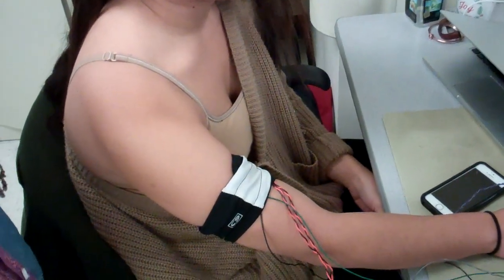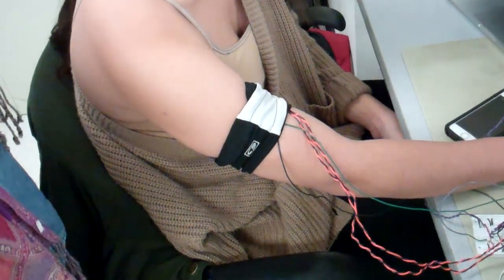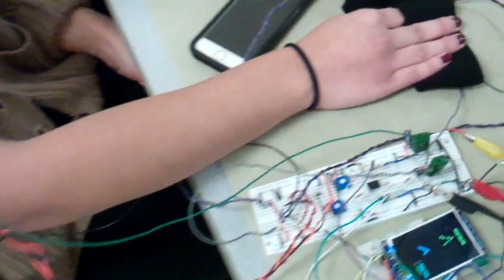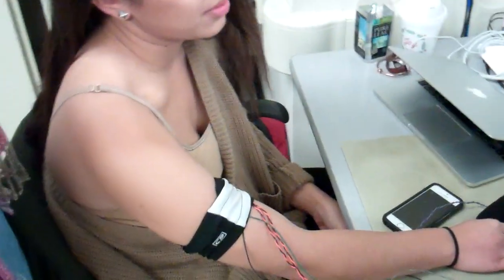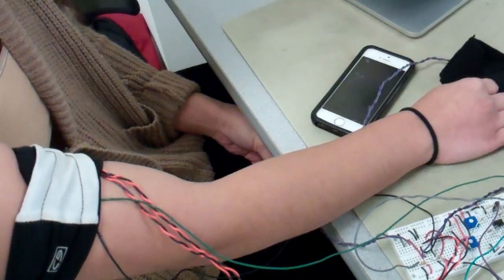You lost your finger pulse. So you have two infrared pressure detectors, one on your upper arm and one on your finger. You know how far apart they are — about half a meter — so you can get the pulse velocity. There are papers showing that correlates rather well with blood pressure, so now you're calibrating using a cuff to get blood pressure non-invasively.